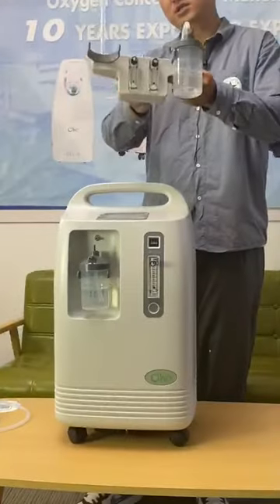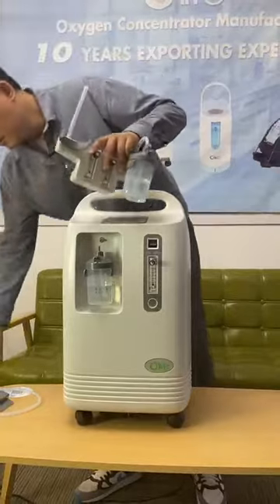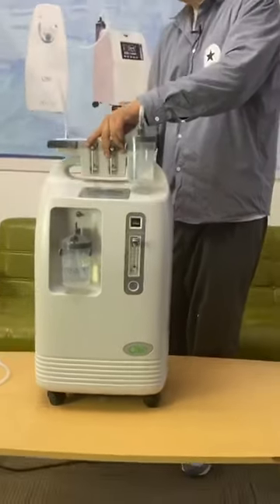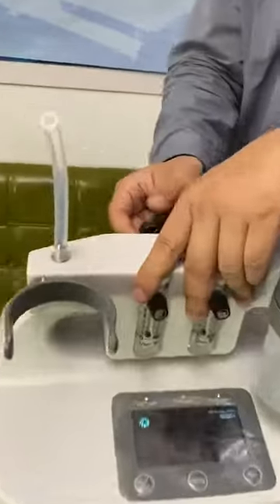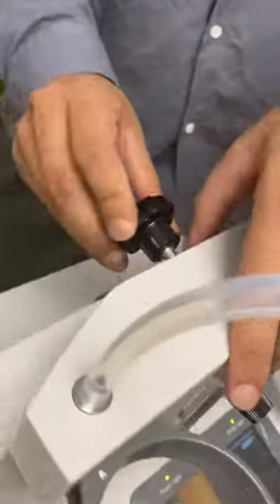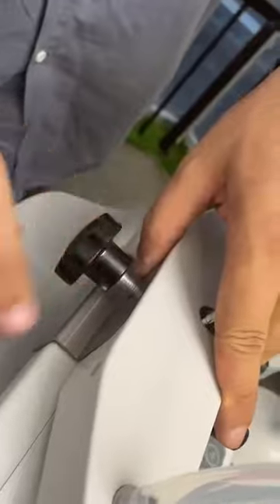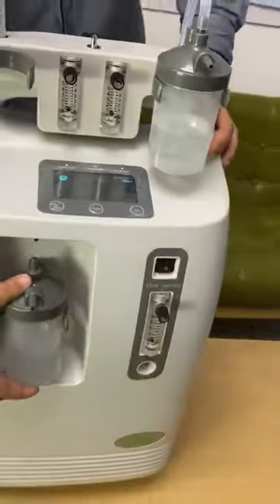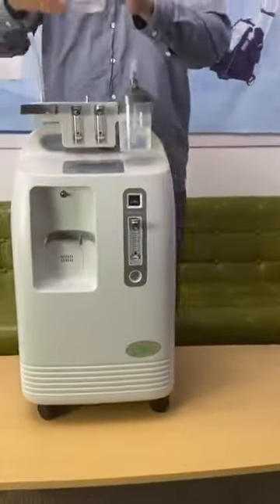You just need this device. You can place it on top of the machine and screw it from the back to make it stable. Then take out the humidifier bottle from the machine.